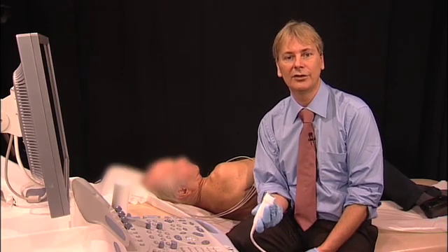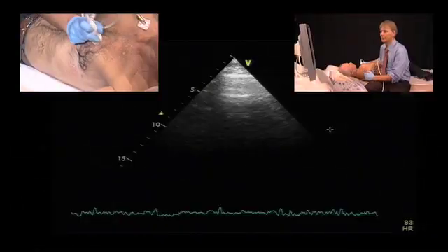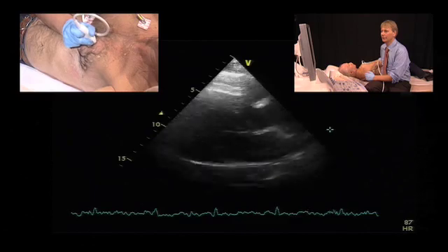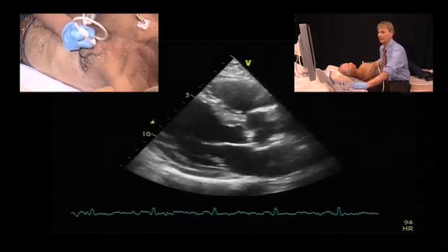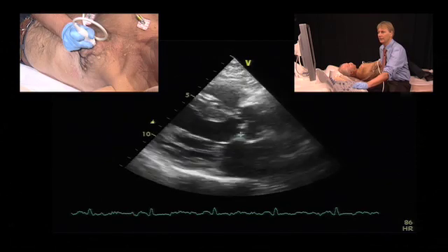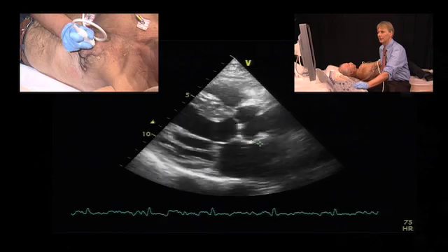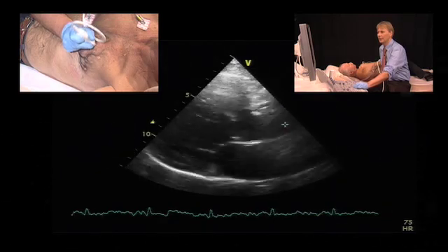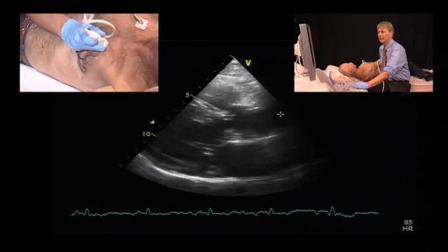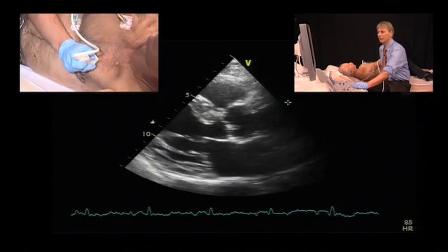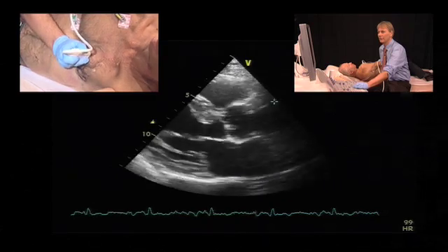These are the segments of the aorta visible from transthoracic echocardiography. First, in the parasternal long axis view, we have the aorta, the aortic valve plane, the aortic root, the sinotubular junction, and the ascending aorta. The cranial portions of the ascending aorta can be seen more clearly if you move the transducer towards the sternum.